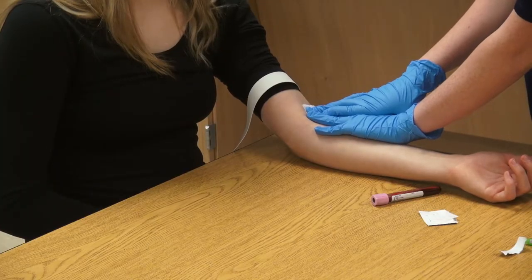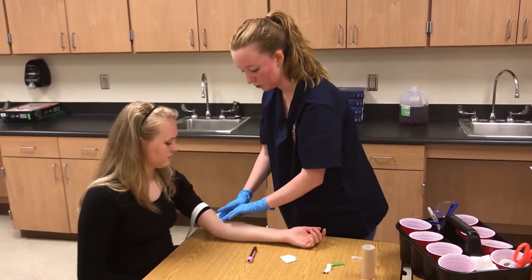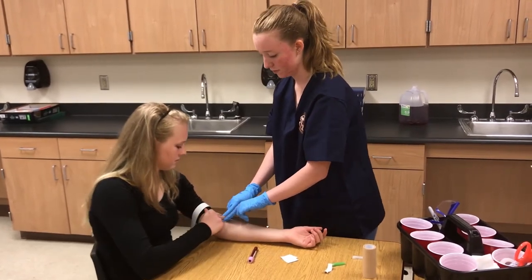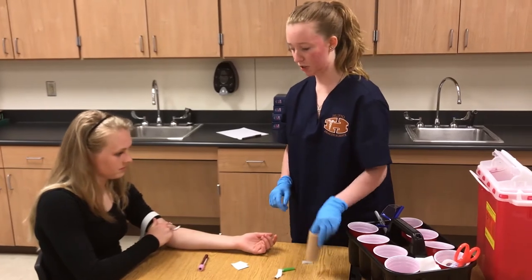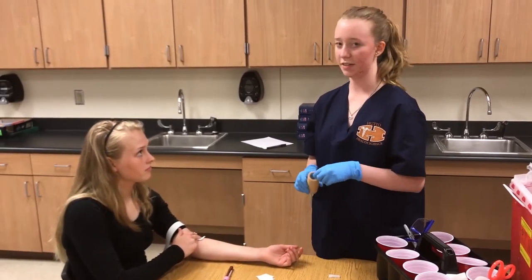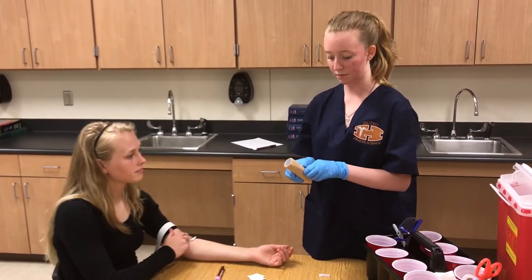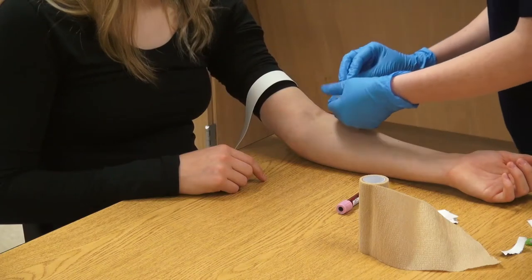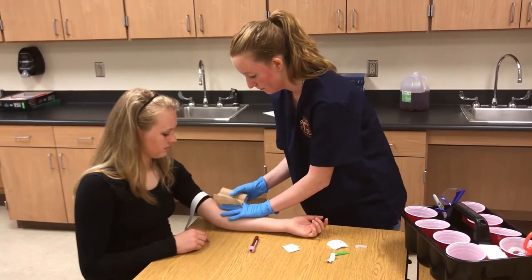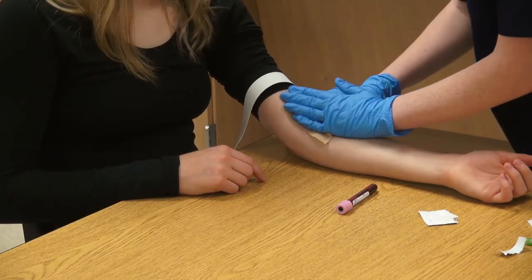Apply pressure to the site to avoid hematomas. You can ask the patient to hold the gauze while you get a bandage or wrap. 'Can you hold the gauze, please?' Ask the patient if they have an adhesive allergy — if so, use a wrap. This patient does have an adhesive allergy, so we will use the self-adhering wrap. Fold the gauze to make it easier to apply the wrap. Make sure you do not wrap it too tight, as it can cut off circulation.